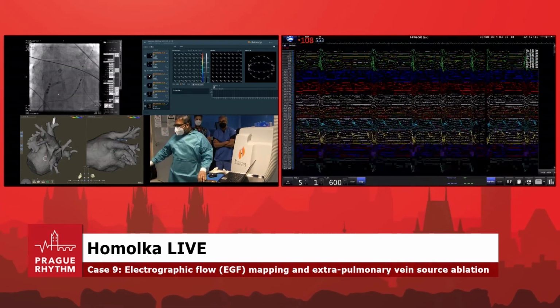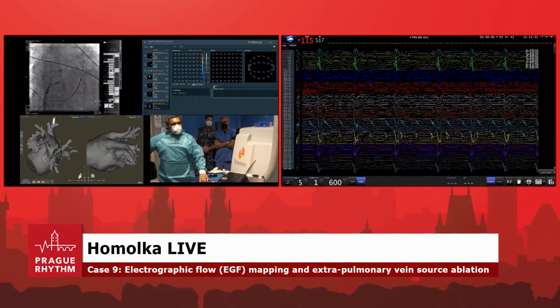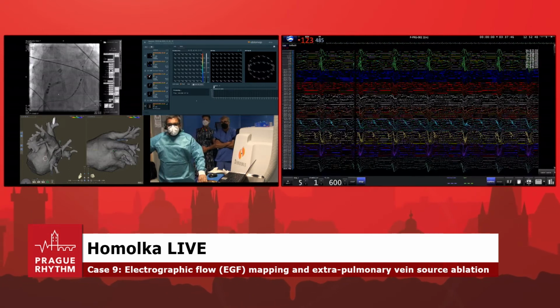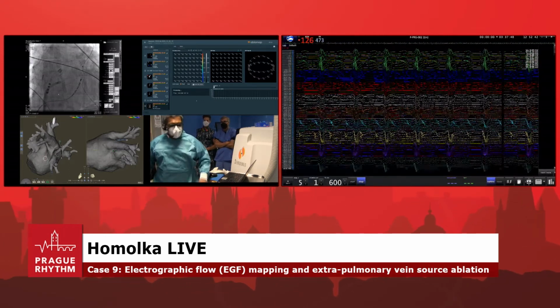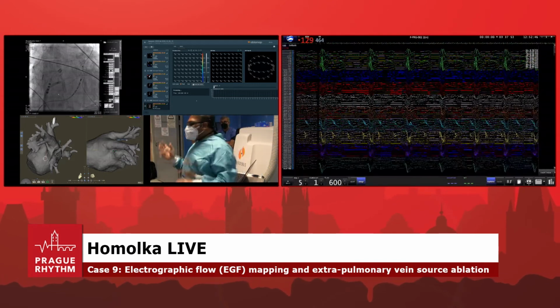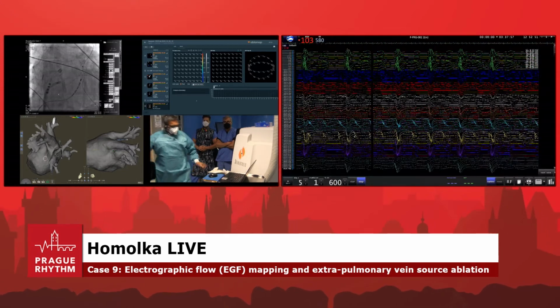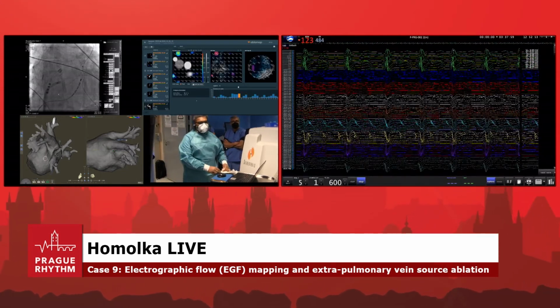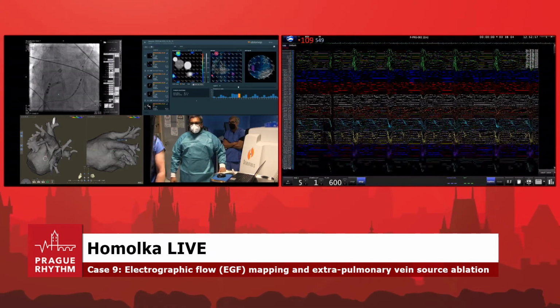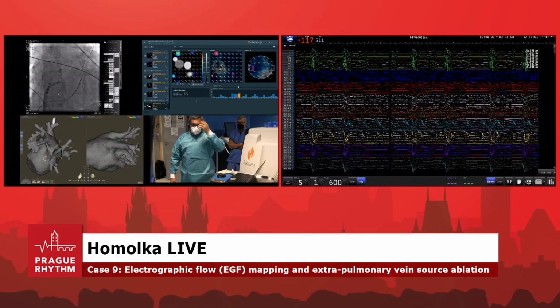And just to be clear, if a source is here, and this is the dominant source, and let's say we ablate it, frankly, the AF may not terminate immediately. It may take some time, or it may not terminate. What we'll end up doing is looking for all the sources, ablating them, and then cardioverting if the patient's still in AFib. Now, you can say, how do you know it's going to work? Well, we're doing a clinical trial called FLOW-AF, an ongoing study. And the trial is actually a randomized trial looking at this.